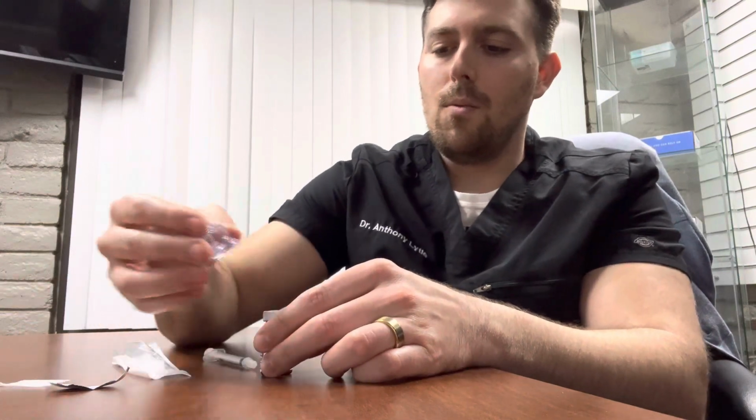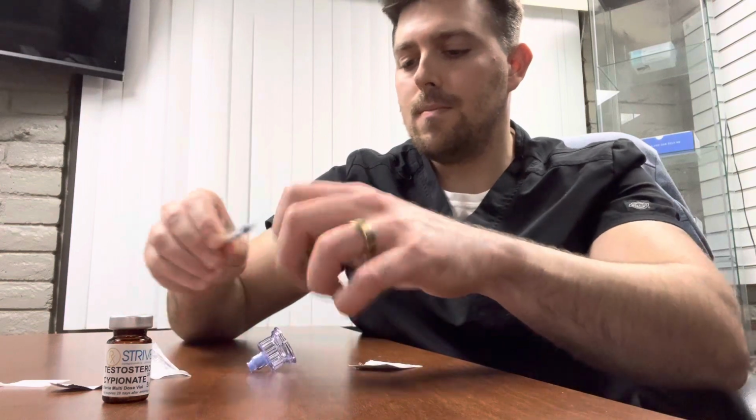I use my alcohol swab on the top of the vial, just to get rid of any contaminants. Then what I would do is apply the Swan Lock topper right on the top here. Now, I'm not going to pierce the bottle, but you would pierce through the little plastic part there.